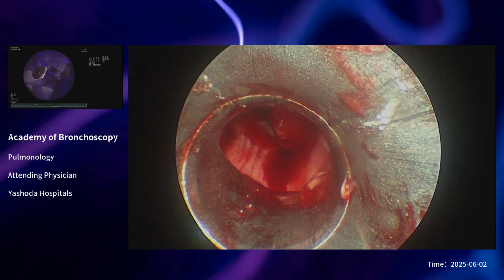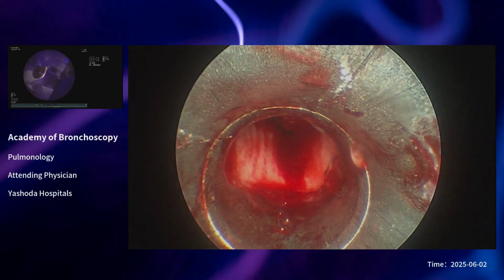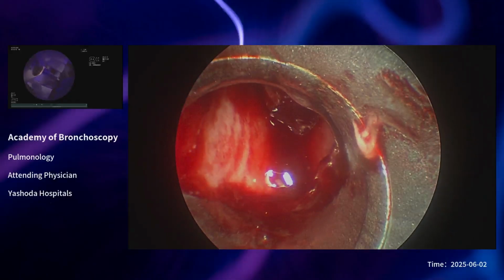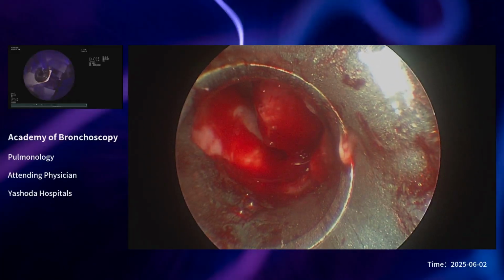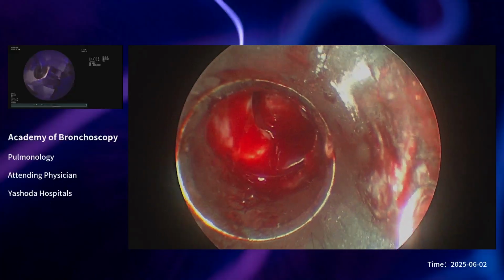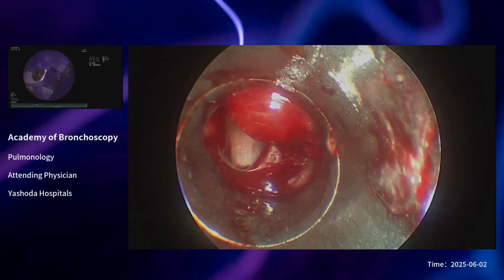Lift and try to go a little close to the tumor and lift. Try to use the bevel to cut the tumor at the base. Lift the barrel. Rotate slowly.